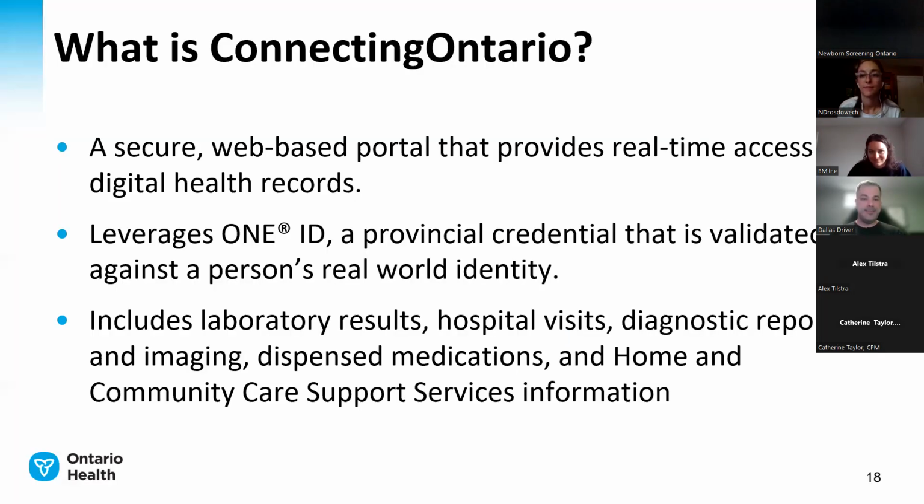Next slide, please. Perfect. So what is Connecting Ontario? Connecting Ontario, and by extension Clinical Connect, are secure web-based portals that provide real-time access to digital health records that are held by various provincial repositories. Access to Connecting Ontario leverages OneID, which is a provincial credential that is validated against a person's real-world identity.